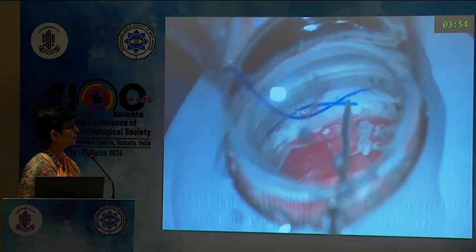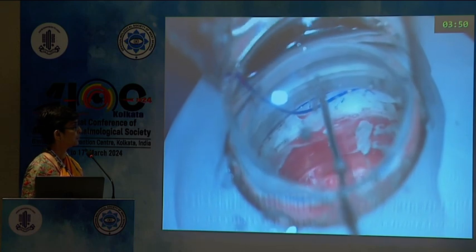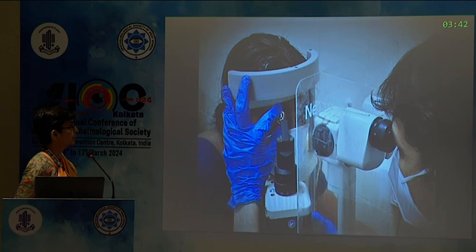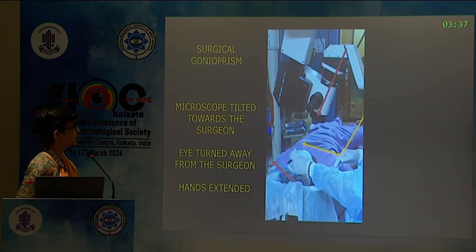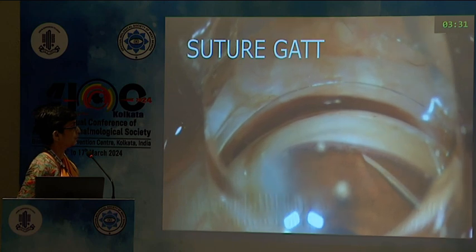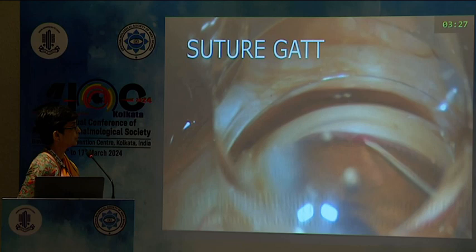The surgeon can undergo any number of training sessions with this model. The practice of GAT is achieved by performing a large number of office gonioscopies. Next, the surgeon practices observing the angles using the Swan-Jacob gonio lens. On transitioning to a real surgery, the anterior chamber is filled with a higher end OVD.